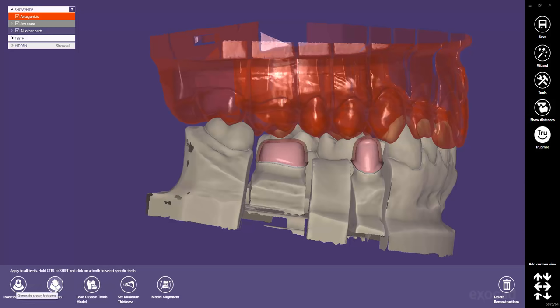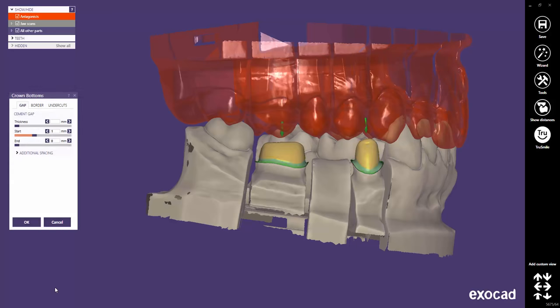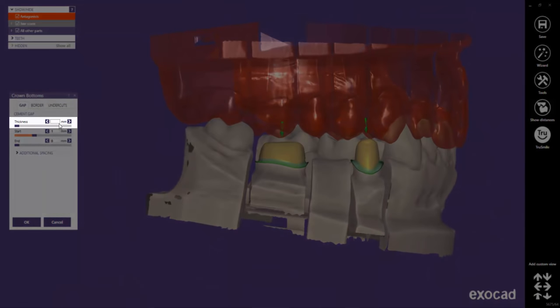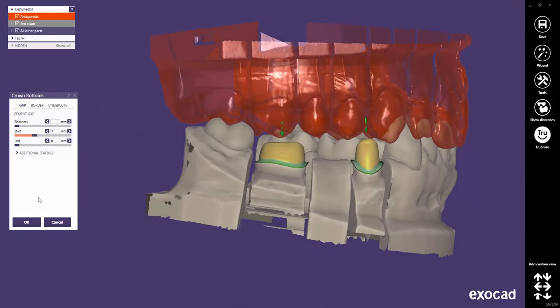If, for instance, you open the cement gap settings again without any tooth selection, no value will be displayed for the cement gap thickness, as individual values have been set before. If you set a value now, it will be applied for all teeth and overwrite the individual setting you have done before.